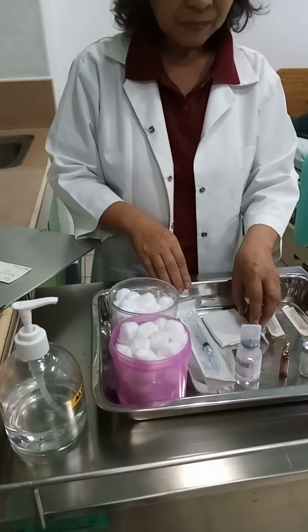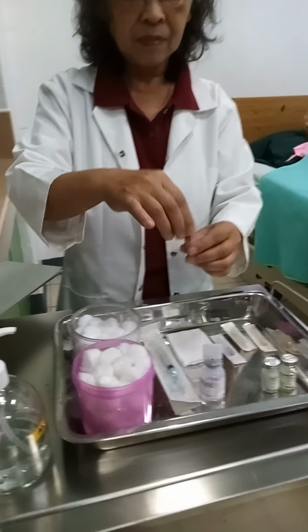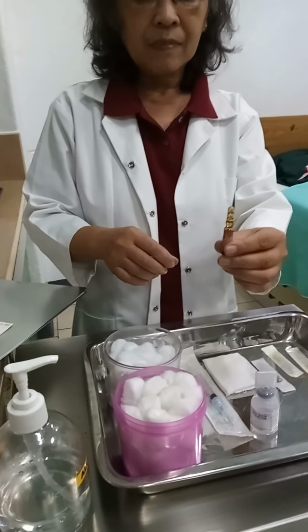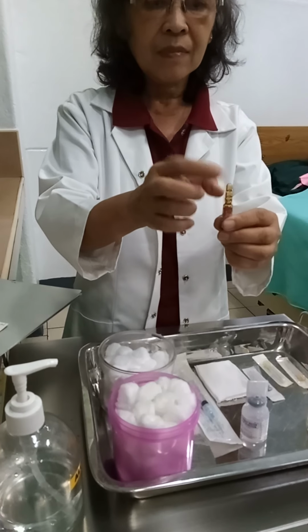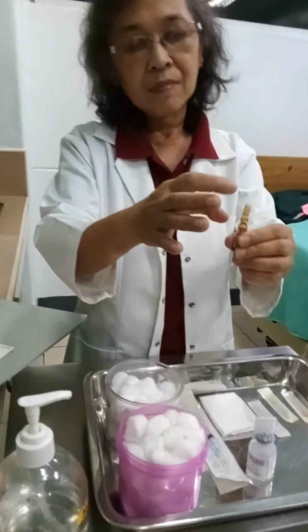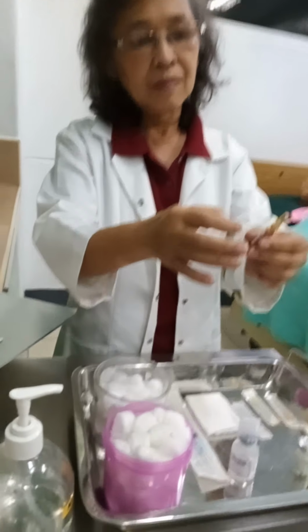Withdrawing medication from an ampule. Tap the ampule lightly and quickly with a finger until the fluid leaves the neck.